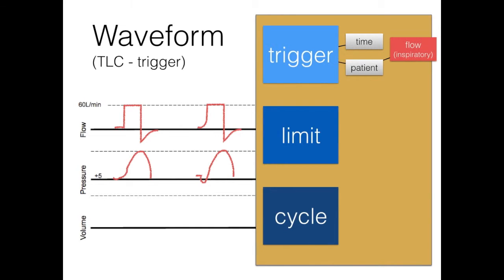The patient-triggered breaths can occur by the ventilator sensing an inspiratory flow or by sensing a negative inspiratory pressure generated by the patient. This flow or pressure trigger is generally set by the respiratory therapist and is termed trigger sensitivity. If you look at the following waveform examples, a flow or pressure trigger can be detected by noticing deflections at the beginning of these waveforms, respectively, compared to the machine-triggered waveforms, where no deflections are detected at all.